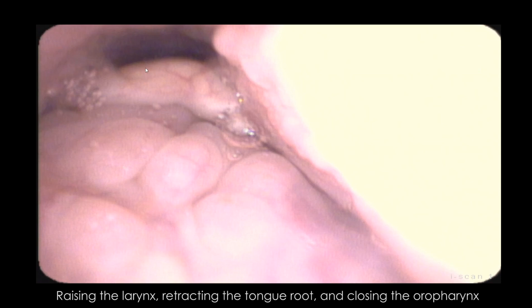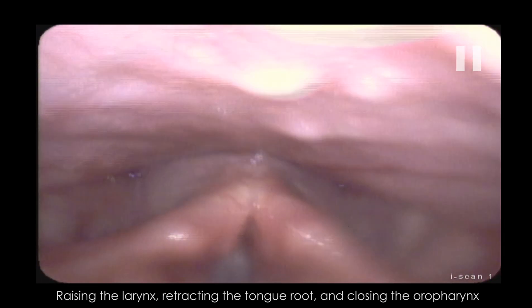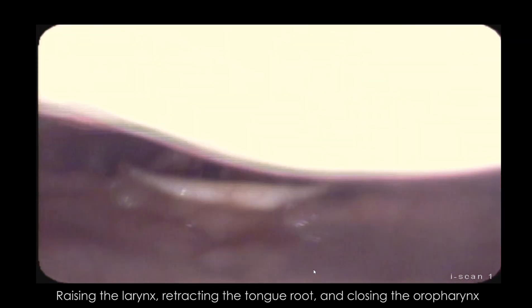We see the tongue root coming back, we see that the epiglottis ends up curving and going all the way back, and the larynx is shifting up. And then I'm like, 'Wow, tongue root!'